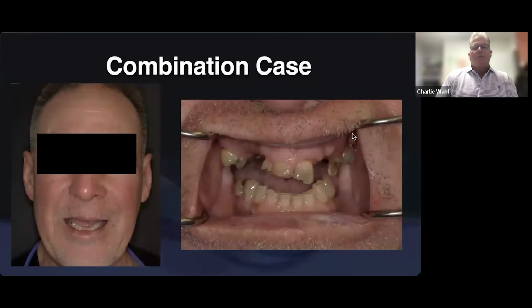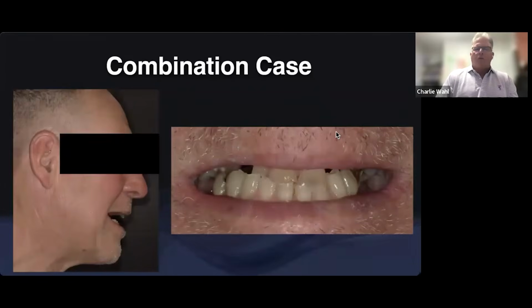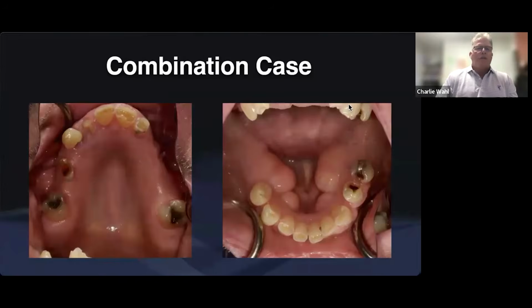And financially, he still wasn't available to look at upper and lower fixed implant restorations. And so we kind of went through our workflow, right? We did our appropriate treatment planning, just going through our Dawson checklists. And we started to say, okay, hey, what can we do? And, look at those tori, right? Can we do a removable denture down there? I would say no, right? Not without a lot of effort and grief.